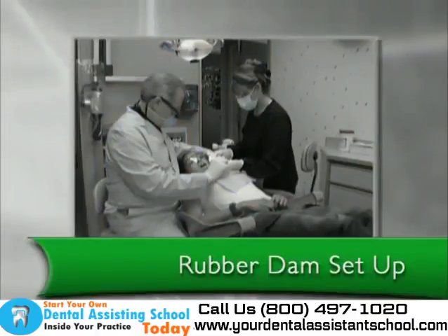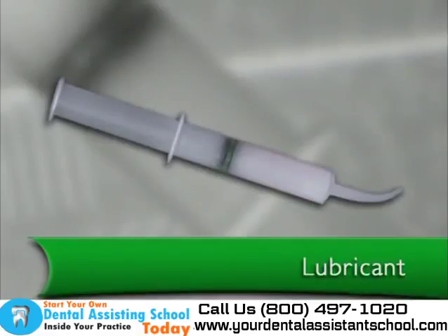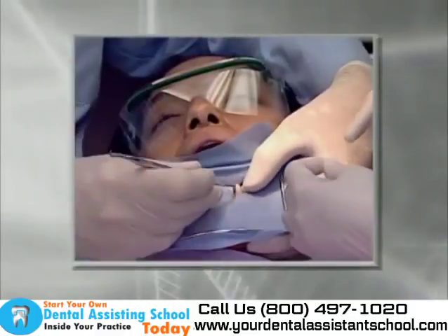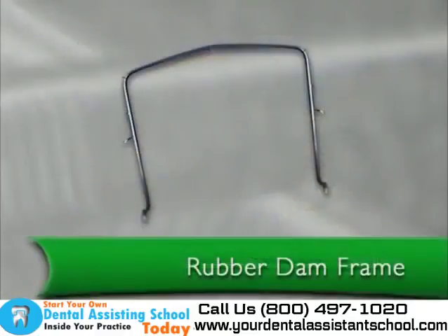A typical rubber dam setup includes a topical anesthetic, lubricant for the patient's lips, and rubber dam material for isolating the tooth. It is a flexible material that comes in a range of thickness and colors. The thickness of the material used depends on the space between the teeth to be isolated. A rubber dam frame for holding the rubber dam material in place. Frames come in plastic or metal.